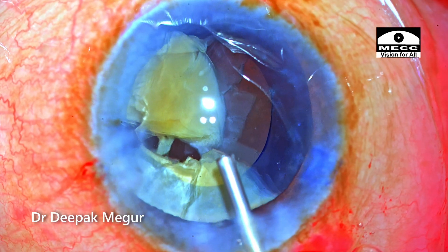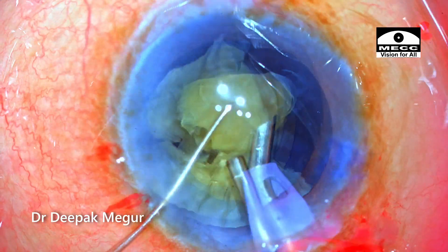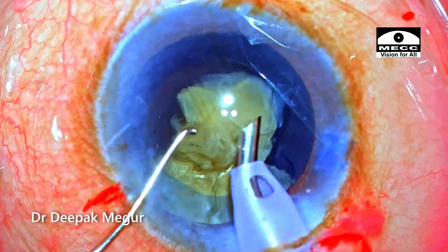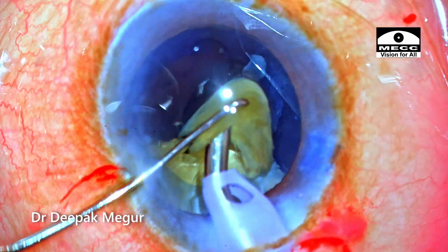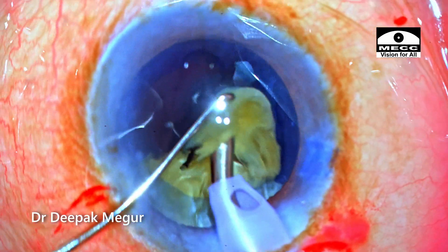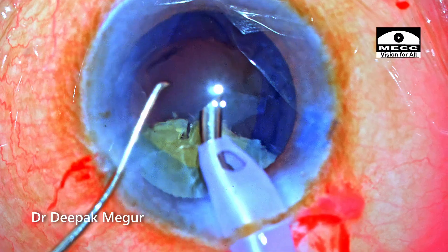Before emulsifying the second part of the nucleus, I am going to inject some more OVD and then proceed with dividing the remaining half of the nucleus. The usual principles of managing the fragments in the posterior plane and keeping turbulence and lens chatter to a minimum are being followed.